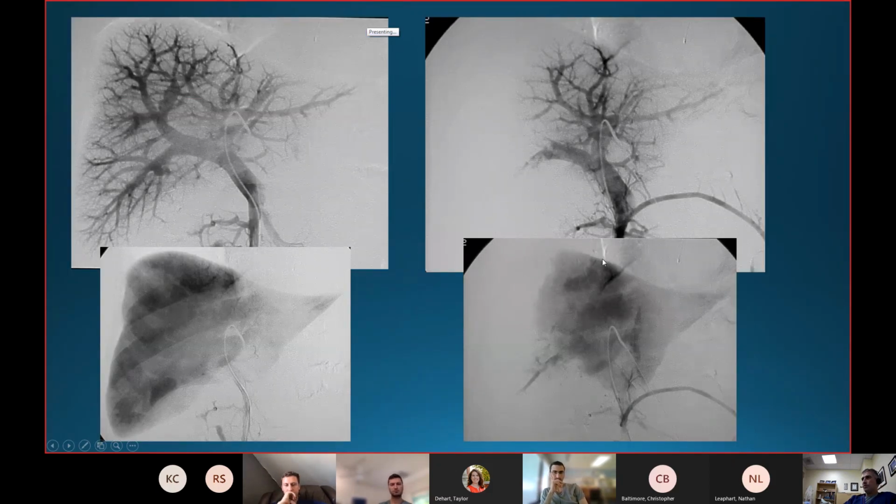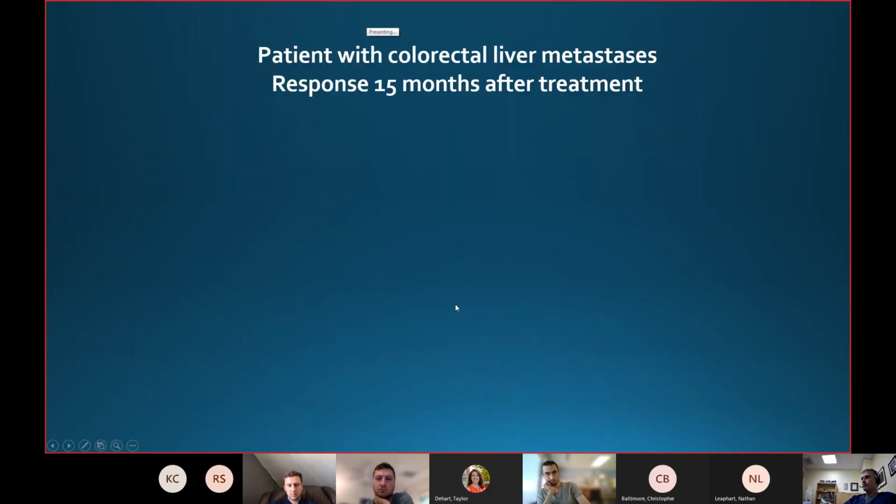This is another application of embolization in the portal vein. This is in a patient that's going to get a hepatic resection, like a lobectomy. Because they don't have enough liver after the lobectomy, they want us to hypertrophy the liver so that they can remove the side of the liver that has the tumor, and they can still have a hepatic remnant that's enough for them to survive. So that takes a few weeks. So we embolize the portal vein, cause hypertrophy of the left side so they can chop off the right side.